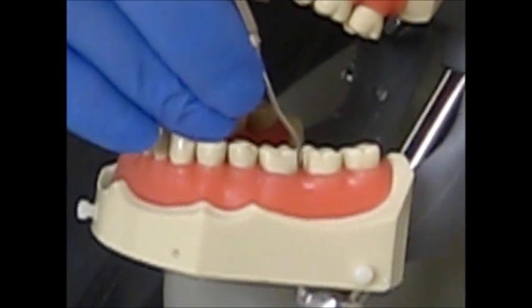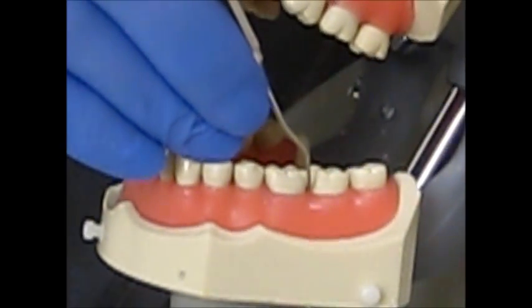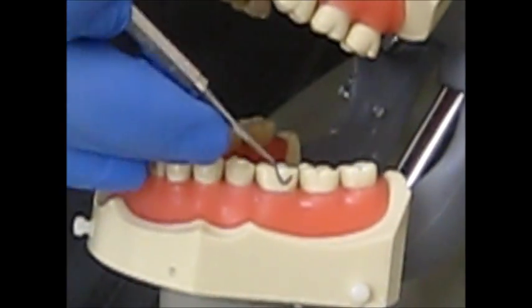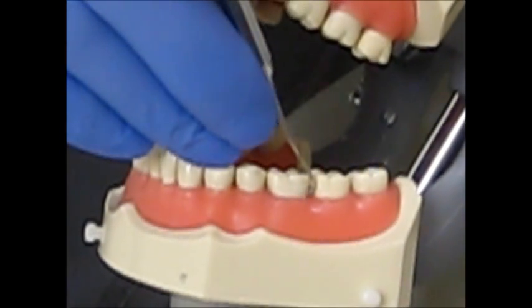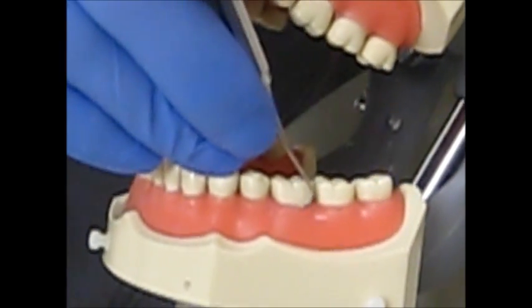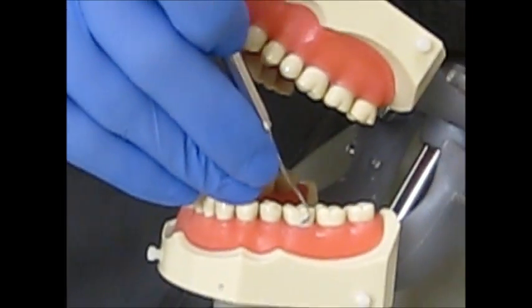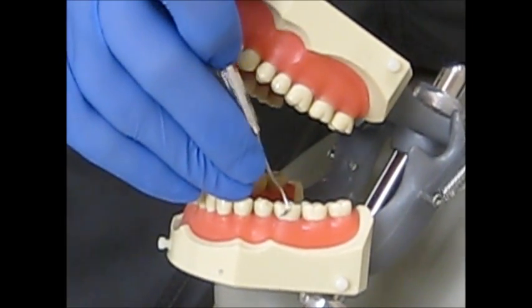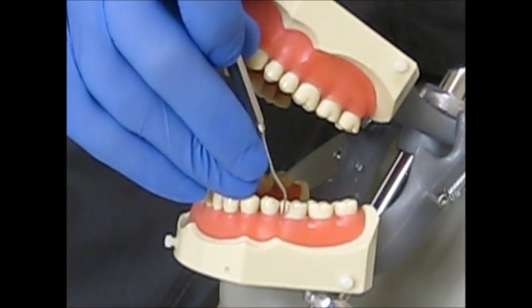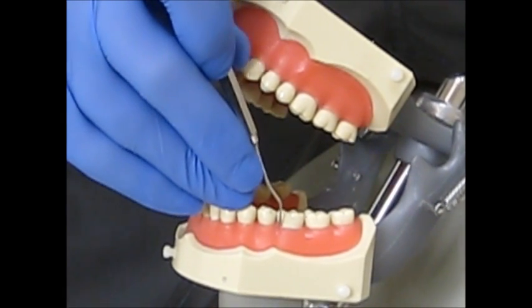The sequence would be distal line angle to distal interproximal, rotate, keeping the same working end, distal line angle to mesial interproximal.